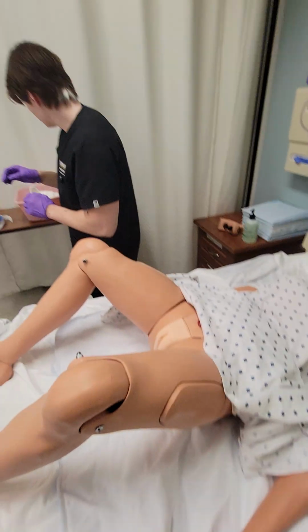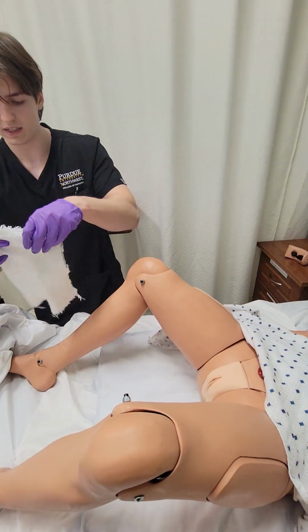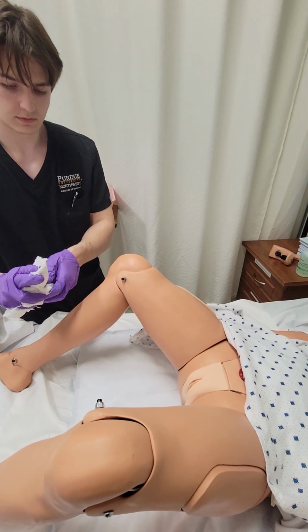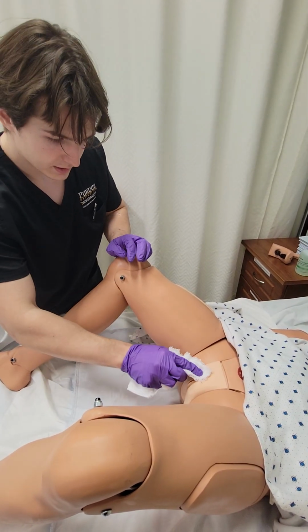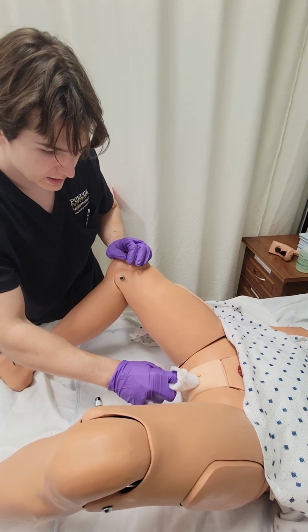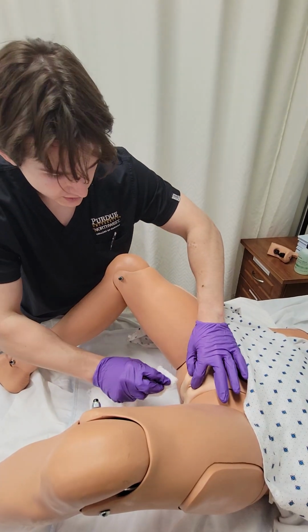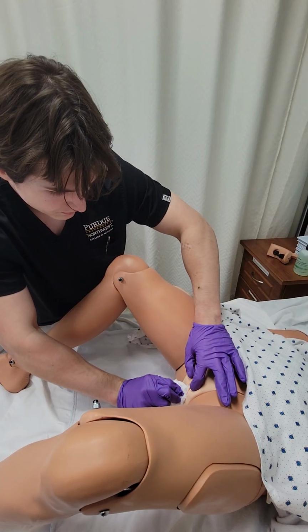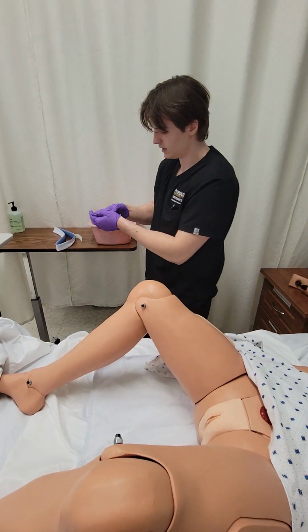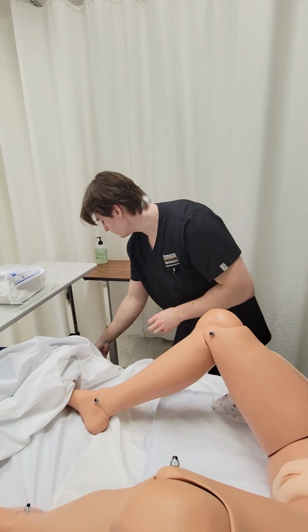Alright. So now I'm going to clean with the aforementioned rags, starting in one corner and going side, moving to another corner, side, moving to third corner, spreading the labia and going down the middle. Alright, pericare done. Just gonna move this off to the side.